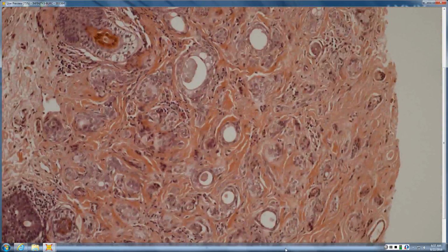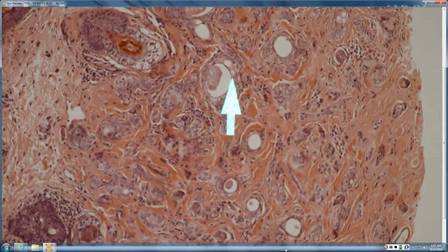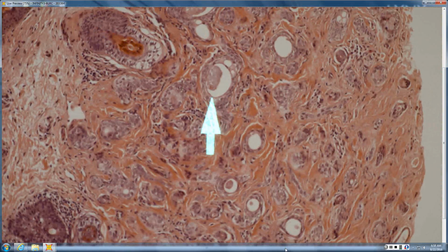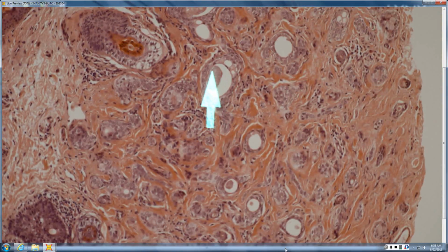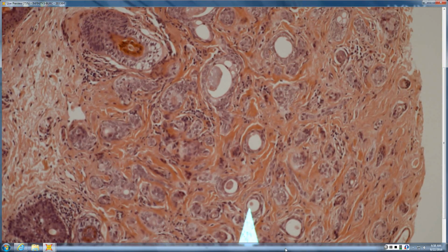Getting close, you see that brighter eosinophilic lining of what looks to be a good duct, and then within you get this amorphous material. That's not keratin flakes, it's not like a horn cyst. So these are actual little ducts that are forming. So, syringoma.